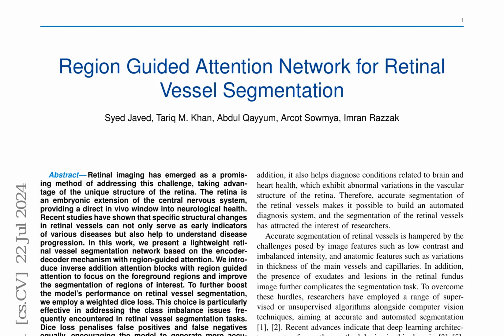Retinal vessel segmentation is a promising method for diagnosing various diseases, including neurological disorders, by analyzing the unique structure of the retina. The retina provides a direct in vivo window into neurological health, and specific structural changes in retinal vessels can serve as early indicators of diseases.